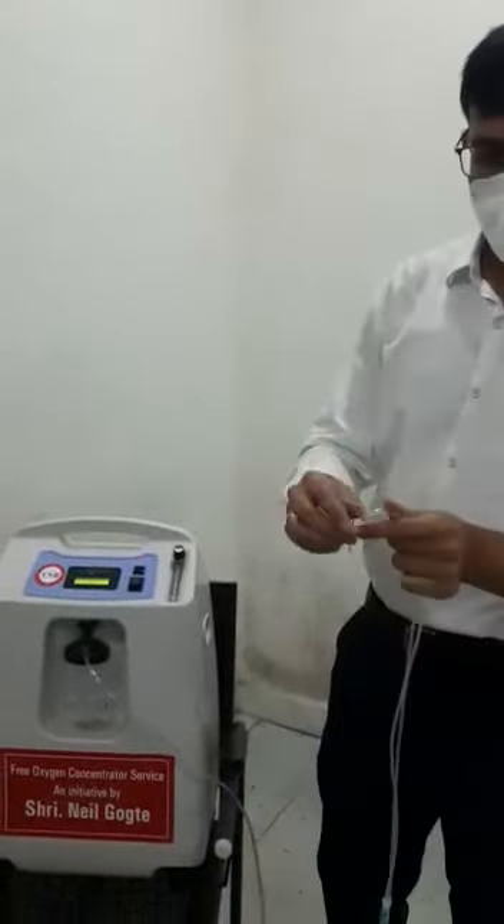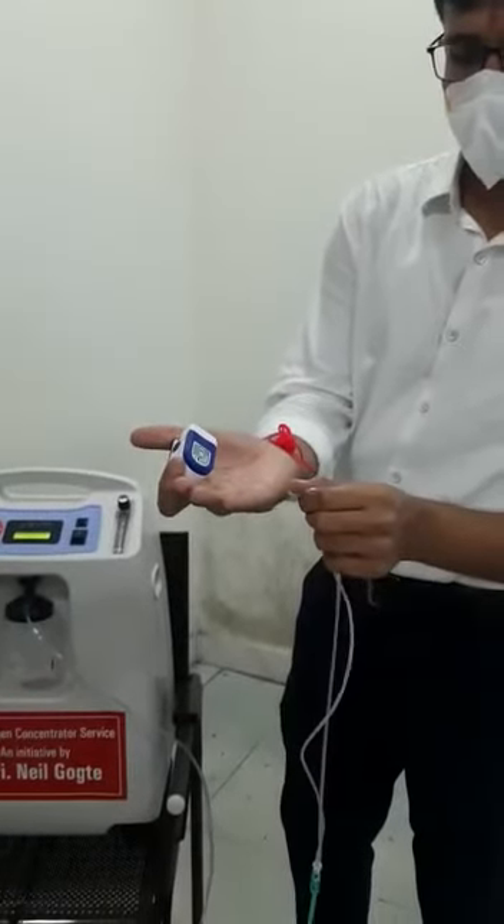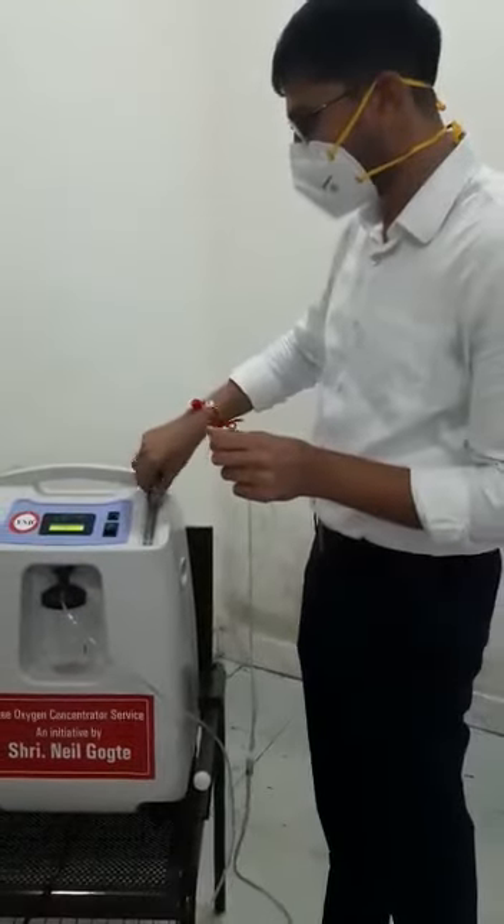To know if the oxygen is coming or not, you can put the cannula near your hand like this and feel that air is coming — that means it is running properly. You can hold it closer and feel it.